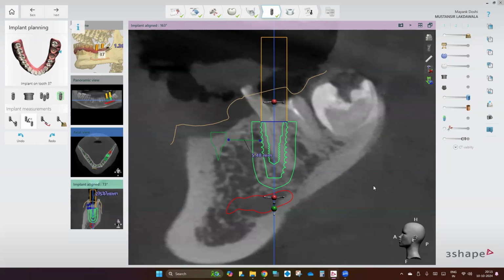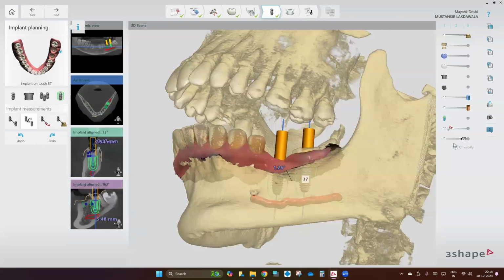So in this case, the furcation area is intact, but most of the time we are getting cases with furcation involvement. So in such cases, the same implant planning should be suggested? My point is, whatever happens, this is the only prosthetic possibility.